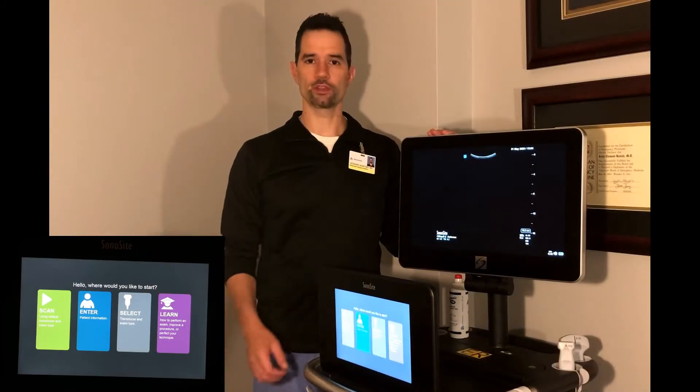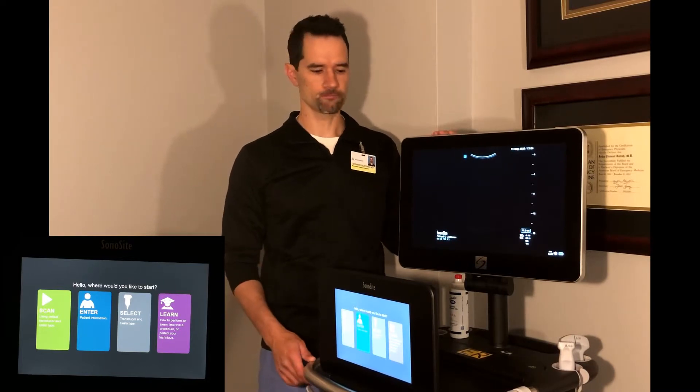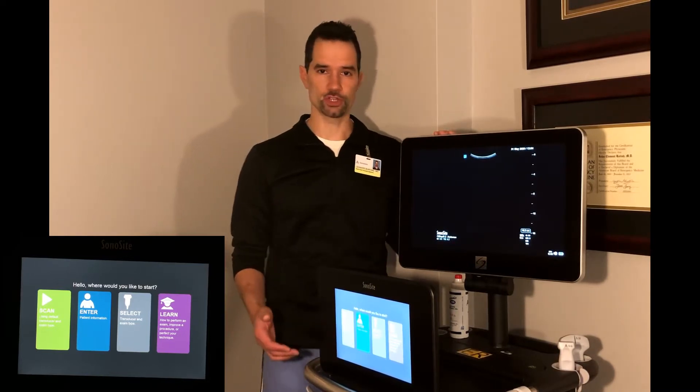Hello everybody. I wanted to go over the ultrasound machine. This is our new ultrasound machine — this is a Sonosite. A brief overview of the machine.